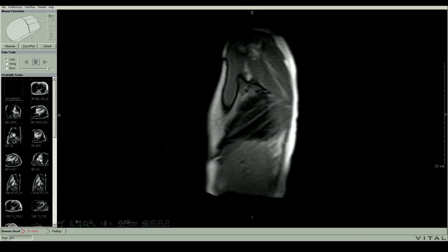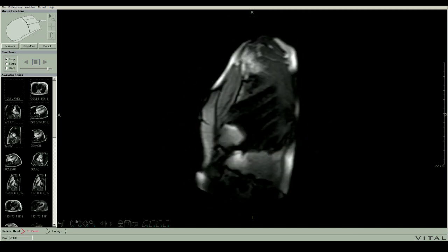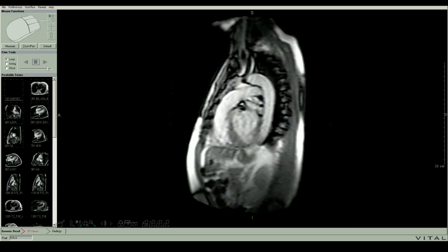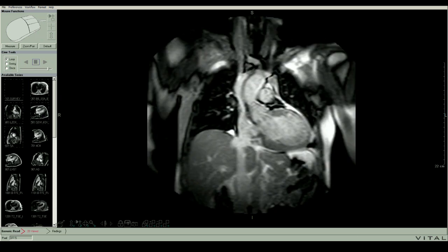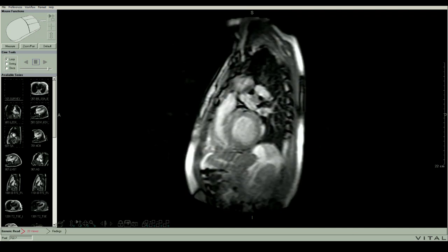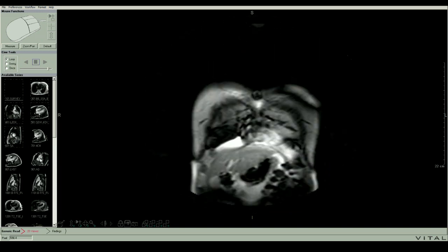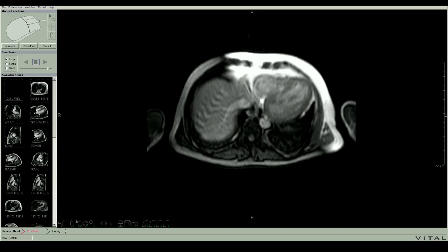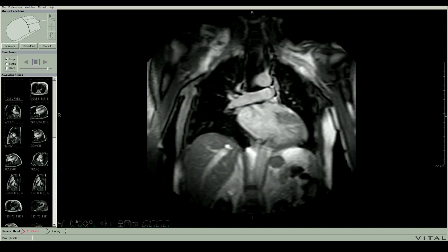MRI. Let's look at his MRI. I think you're getting used to seeing these MRIs. This is called a survey. This is where we take pictures, coronal, sagittal, and axial, for heart location, to get the heart central in our imaging. So this is like a finder, trying to find the heart, get it in the center of our field. We do that with these quick images, so they're really not of diagnostic quality. There's a lot of motion artifact.